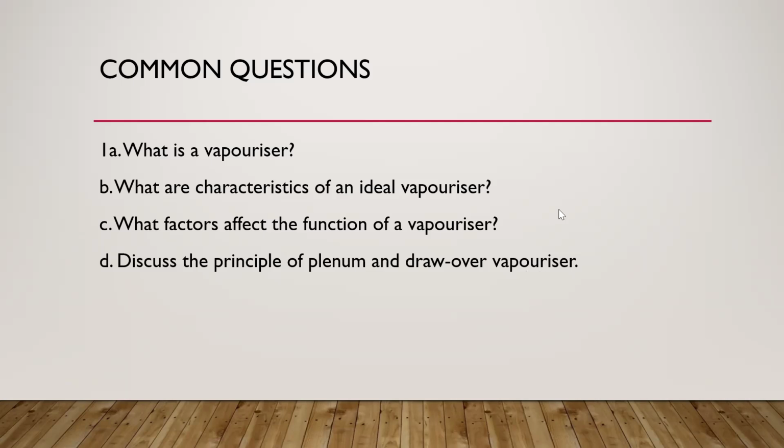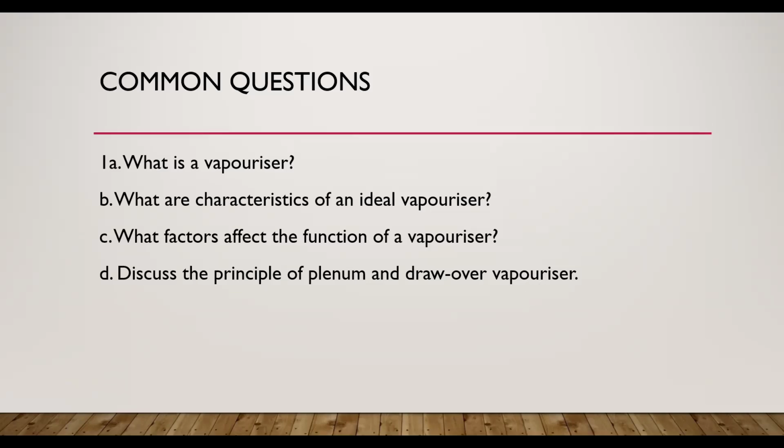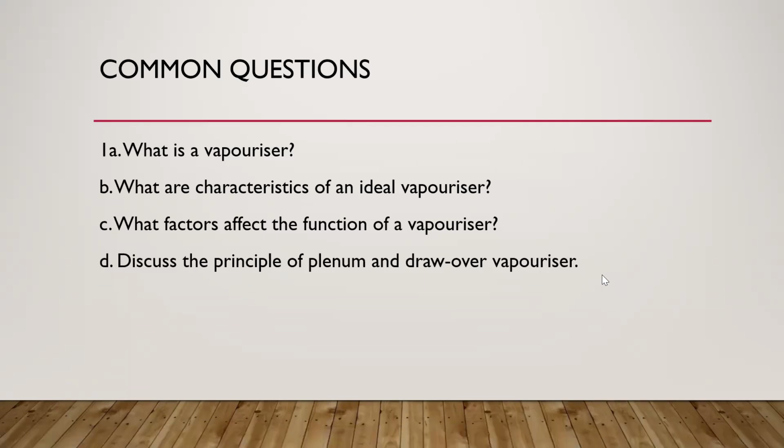These are common. I don't know if exam questions have changed, but these were common questions in those days. Maybe also when there is an increase in static charge causing the bobbin to stick to the walls. Beautiful. Any other one before I answer the question?